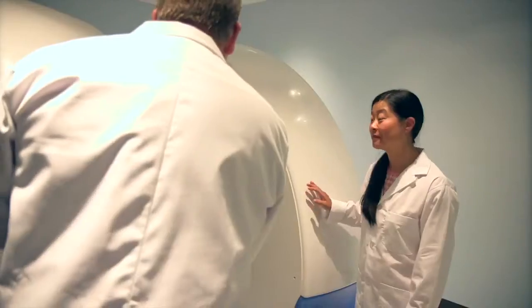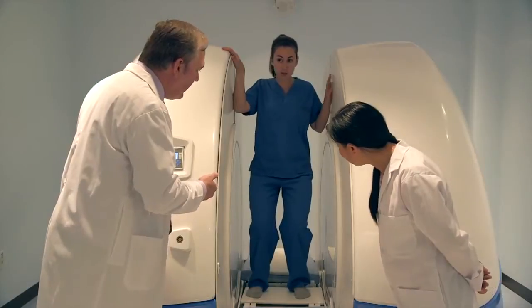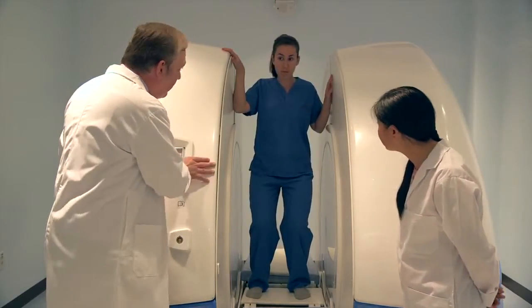What's unique about our open upright MRI scanner is it lets us scan people in everyday postures like standing, sitting and squatting. Now in a normal MRI scanner you can only scan patients when they're lying down, but if you experience joint pain you know that you experience it most strongly when you're actually using your joints.